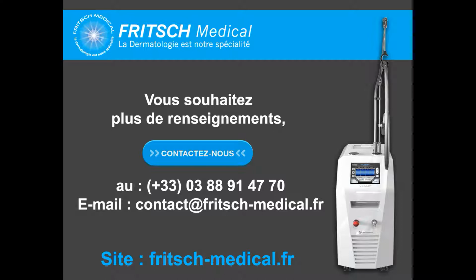For legs, it's important because you have more diffusion of the thermal effect. So maybe 5 degrees is very important. And you have to wait a few seconds after each shot. I think it's more important to wait more after than before. Sometimes we want to proceed too fast, so it's very important to go slowly.